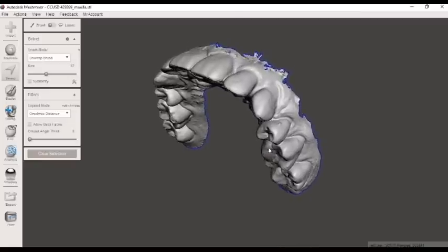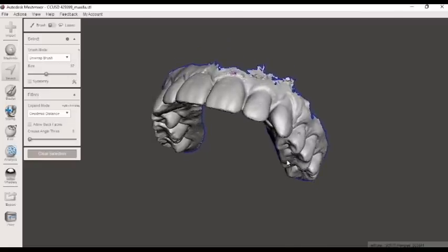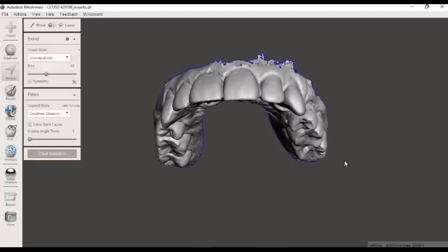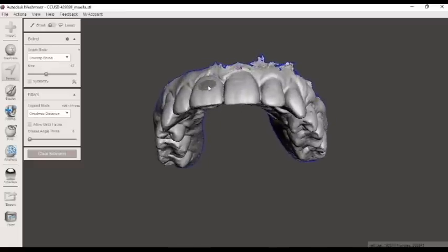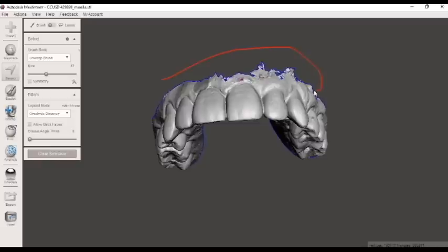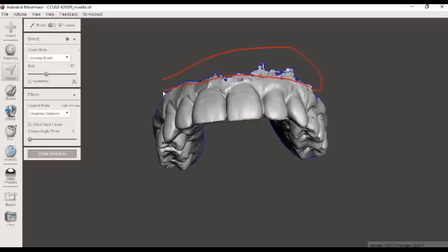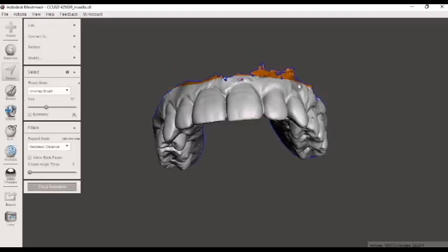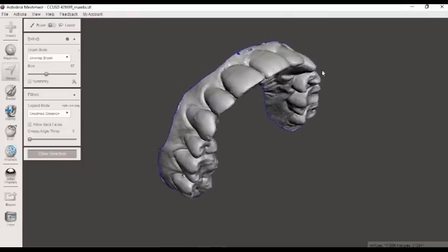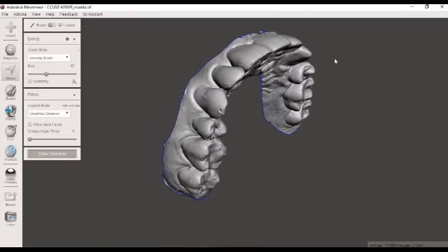So it's important to get this nice, smooth, clean cut because when we create the base on the model, we do it by extruding it. And when we extrude these parts, it will actually create that jagged edge. And we want nice, clean, smooth lines here.